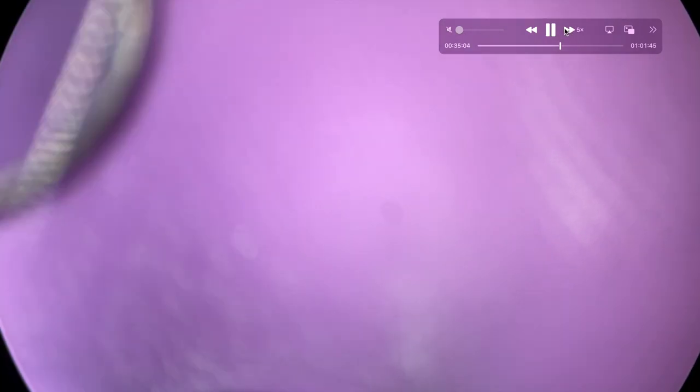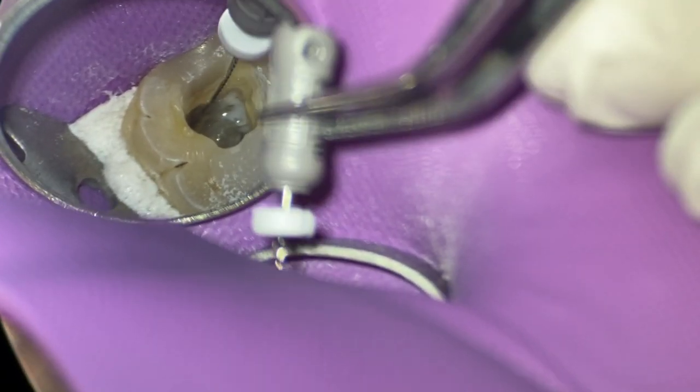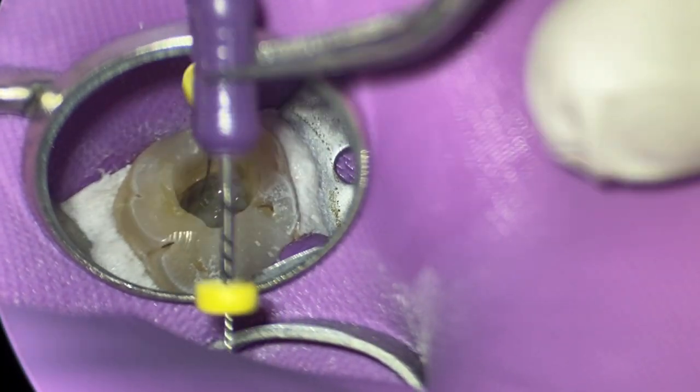What are we going to use next? We're going to use a six file. Place it in there. We're going to watch wind that down. Watch wind, pull. Watch wind, pull. So I'm just going to go through a regular six, eight, ten progression. From here on, I was very fortunate because it's actually a straight canal. The working length was really short.